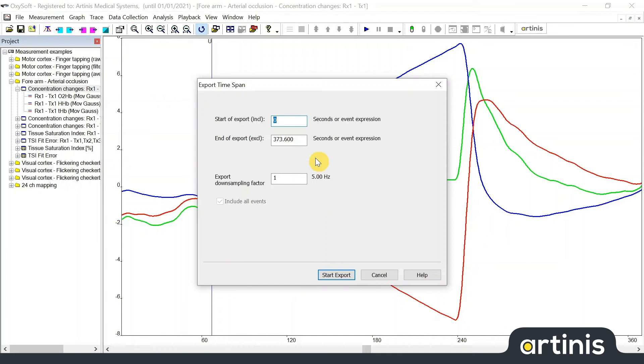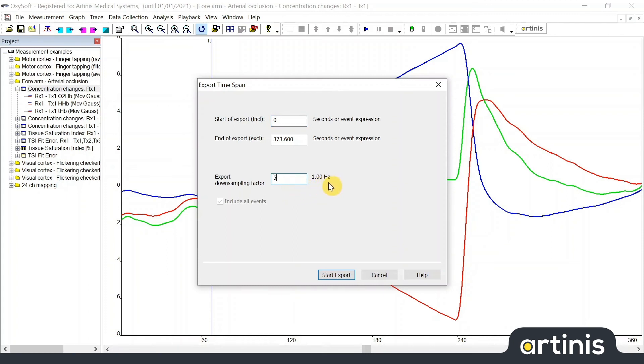Data can be exported with a lower sample rate by using a downsampling factor. The factor is an integer between 1 and 1000. For example, a downsample factor of 5 and a sample rate of 5 Hz will lead to a new sample frequency of 1 Hz. A downsample factor of 1 will leave the sample rate the same. The export sample rate is shown at the right side of the field if it is filled in correctly.